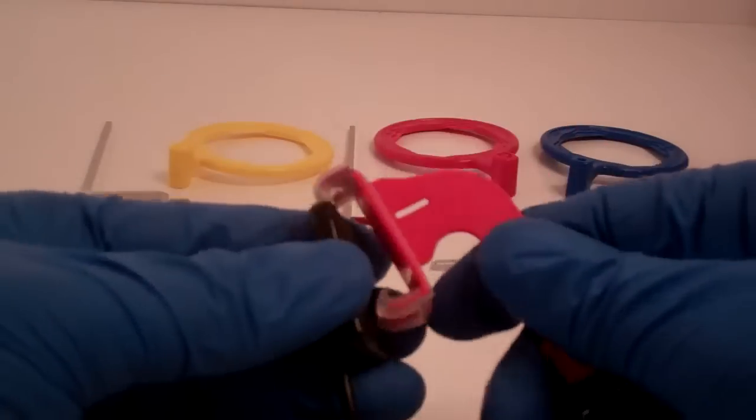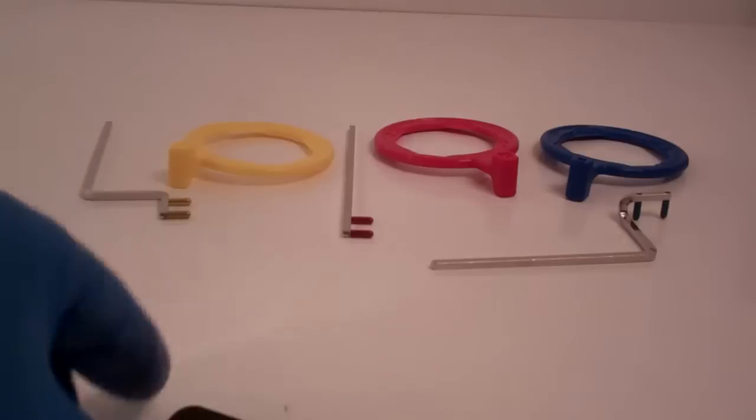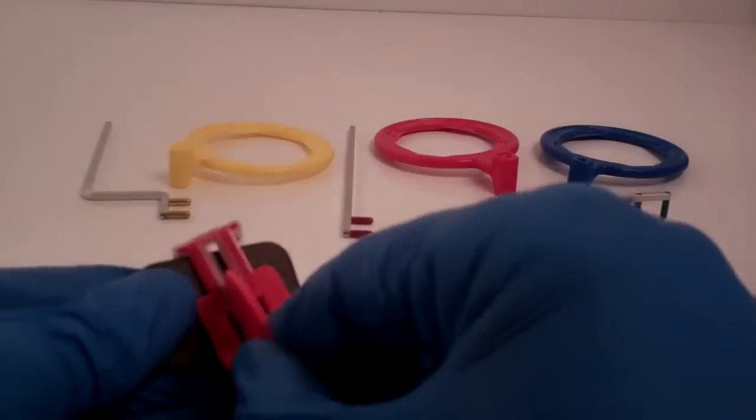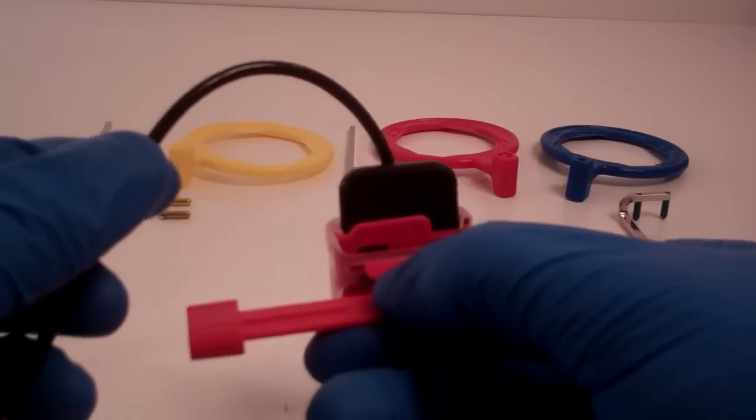And again, that one bite block works with both size 1 and size 2. And there's a vertical bite wing option as well if you prefer to take some vertical bite wings. You want to keep the cord towards the top of the mouth when you're doing the verticals.